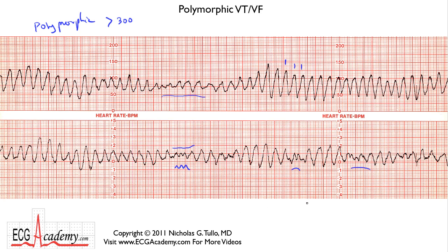And that was really the purpose of this basic level, is to deal with arrhythmias that you'll see on a rhythm strip and to introduce a lot of subjects that you need to be familiar with if you're going to read 12-lead ECGs. The intermediate level of this course will cover all the nuances of reading 12-lead ECGs, including subjects like hypertrophy, atrial abnormalities, and STT wave abnormalities, so you can look for things like ischemia and acute infarctions.